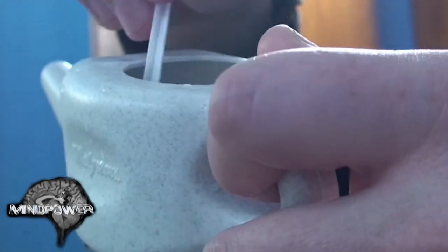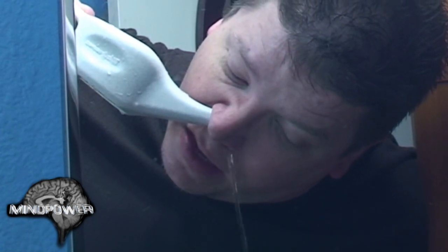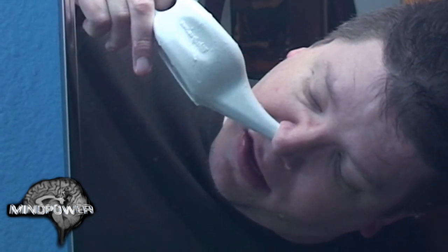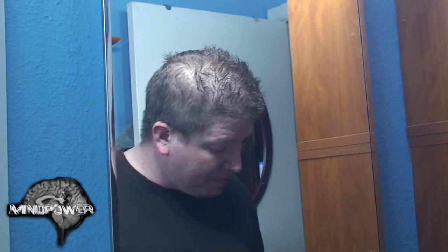Now it's time for the other nostril. You might have to blow your nose a few times after this just to kind of clear out all the liquid that's going through your sinuses.